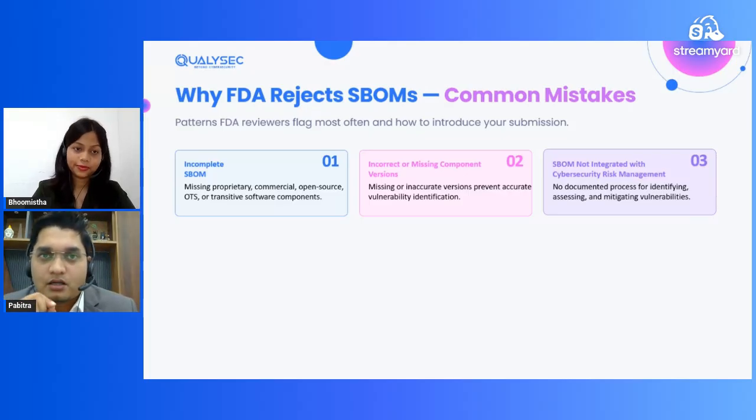The FDA wants to know, using your SBOM, how you make your cybersecurity decisions. It's not whether you generate the SBOM or not, it's how your cybersecurity decisions affect the SBOM. So you have to integrate the SBOM with your cybersecurity management report. These two reports, you have to integrate them.